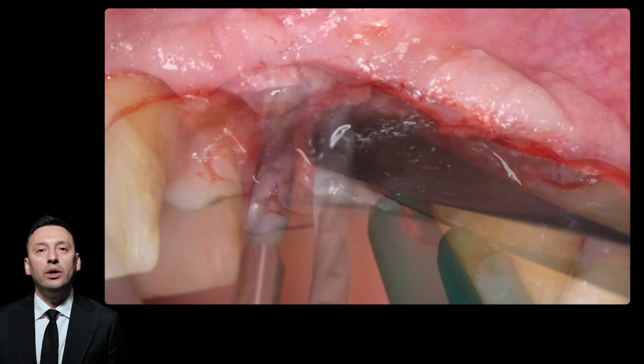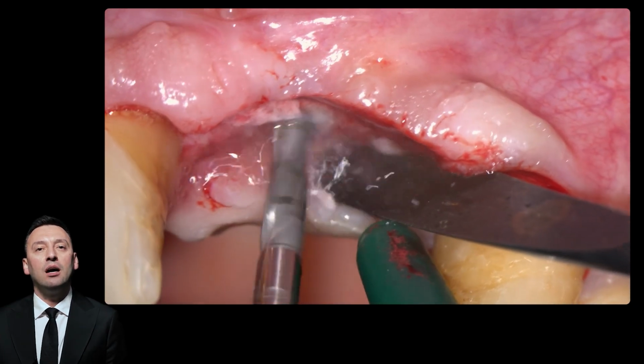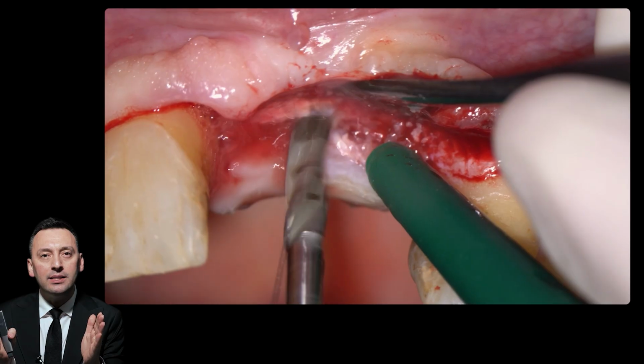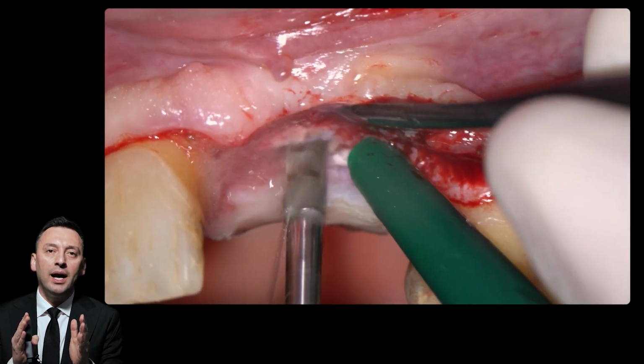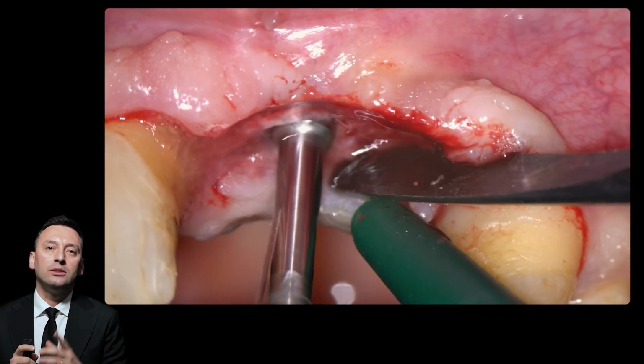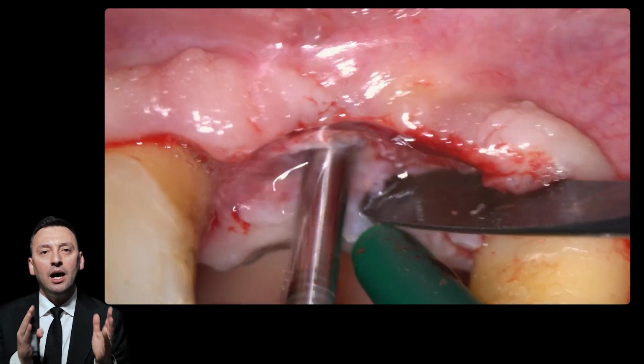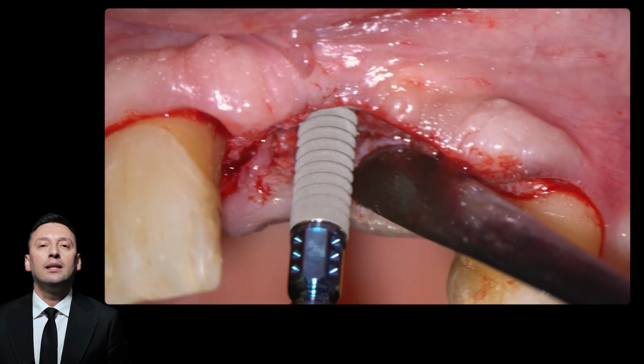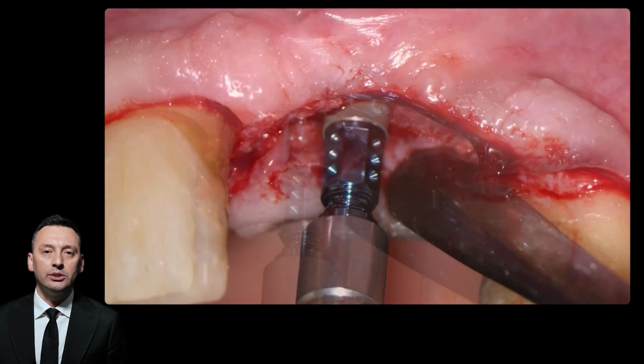And we are going to reach the site after 1 year. Since we have a lack of space, I am going to apply only 1 implant to number 21, and I am going to use a cantilever to support the missing lateral incisor.